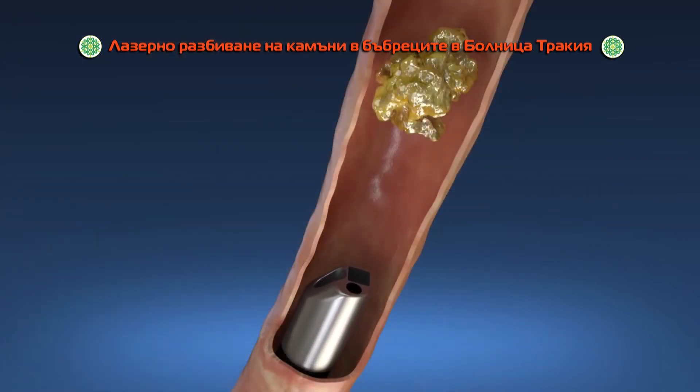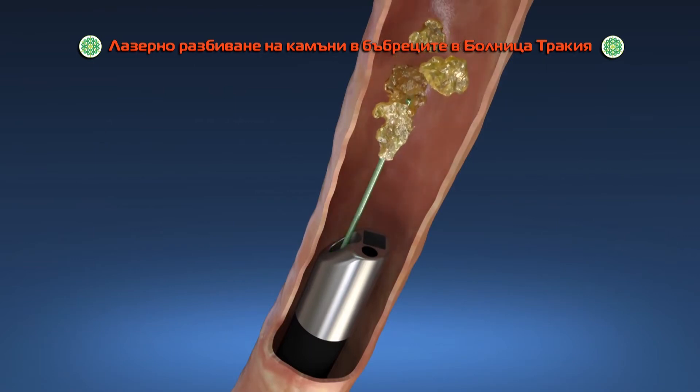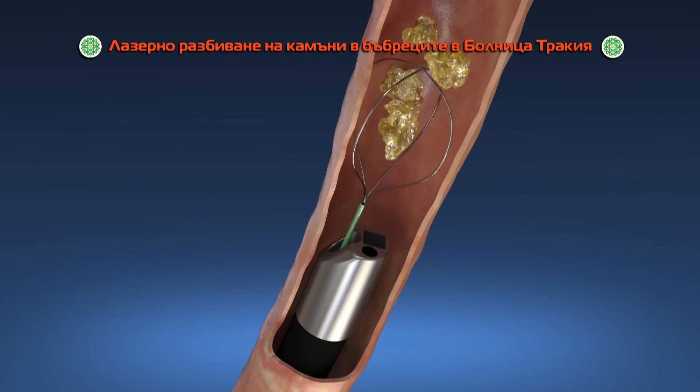The doctor locates the kidney stone and breaks them apart using laser energy, or removes the stones using a small basket.